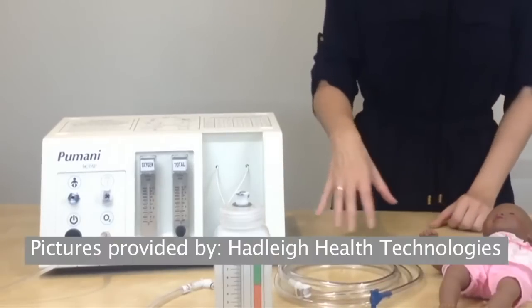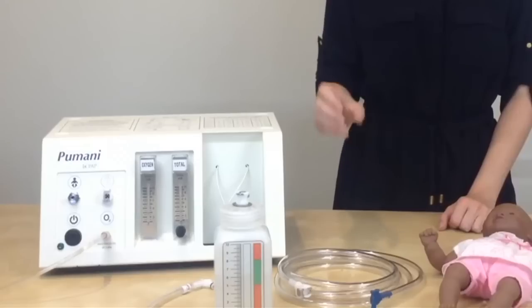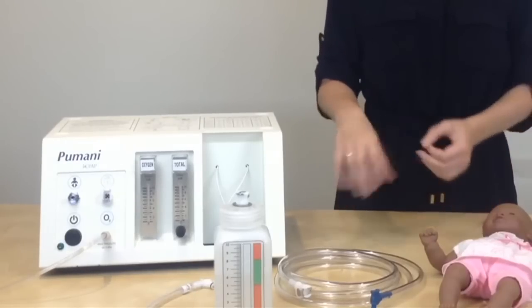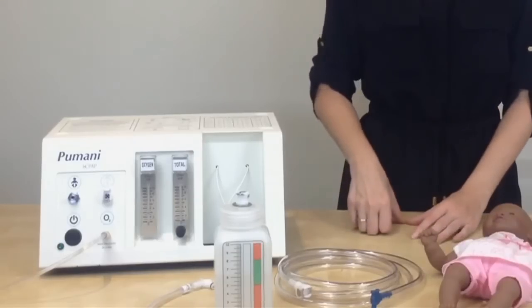Any of the components that you are going to clean and reuse, you can soak in a 0.5% bleach solution for 10 minutes, rinse in clean water, and then lay out and dry the components before replacing on another patient.